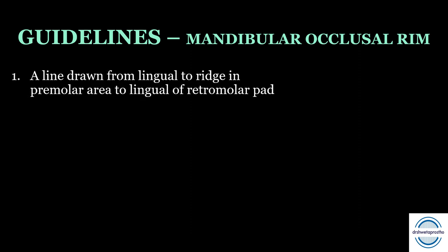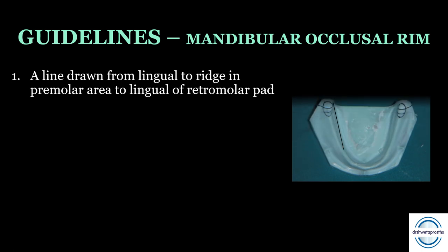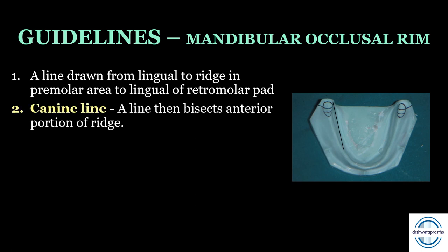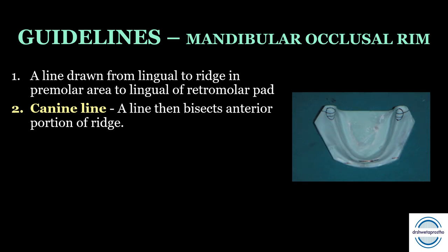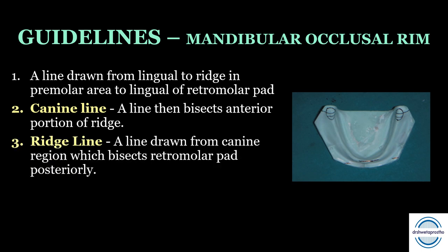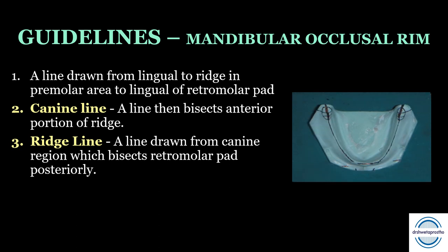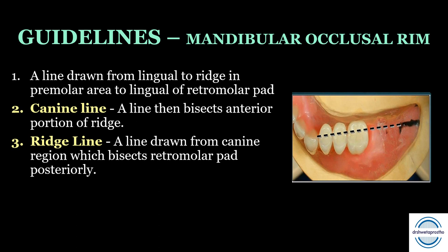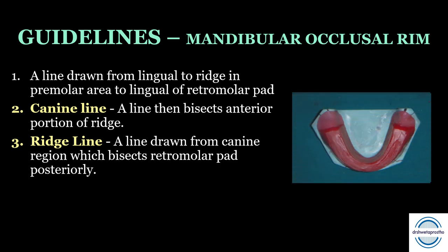For the mandibular occlusal rims: first, a line is drawn from the lingual of the ridge in the premolar area to the lingual of the retromolar pad — this marks the lingual extent of the occlusal rims, which should not extend beyond this line. Second, the canine line bisects the anterior portion of the ridge and marks canine position. Third, the ridge line drawn from the canine region bisects the retromolar pad posteriorly, marking placement of the central grooves of posterior teeth.